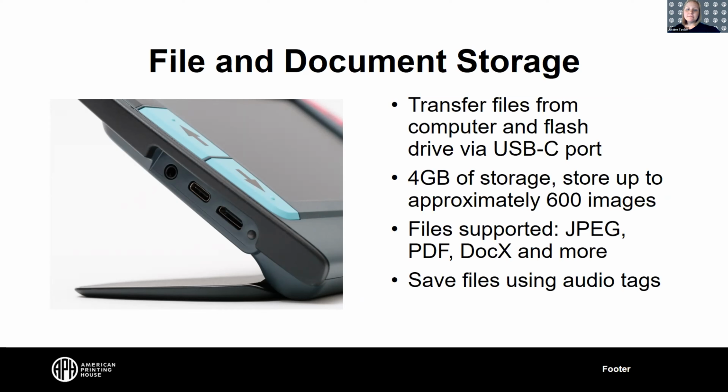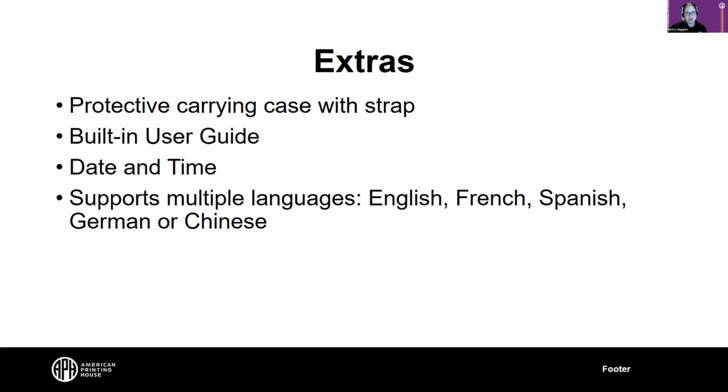Great, thank you for that. We are quickly running out of time, so I want to make sure in these last 3 minutes we talk about some of the extras and what comes in the box for the Juno. We do want to say a big shout out to Vispero, who was our partner in developing Juno. So thank you, Vispero, for your help and your continued support of this project. Juno is going to be a really fantastic feature. So let's talk about those extras, and then we'll jump straight to what's in the box.